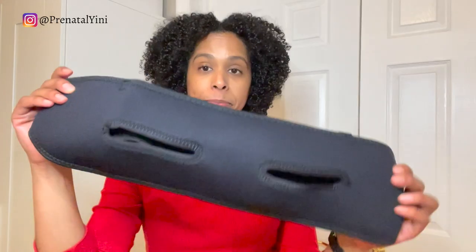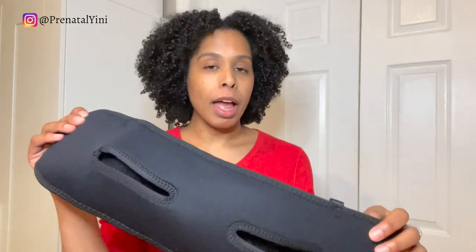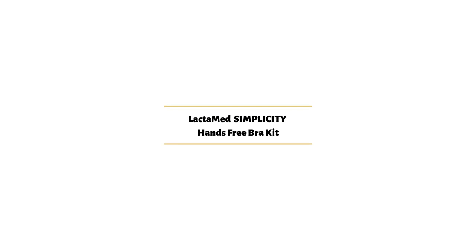Next up is the pump strap — this one claims to be dual as well, so you can breastfeed and pump at the same time. You wrap it around snugly, spin it to the front, and bring it up, adjusting as needed. You're supposed to breastfeed your baby on one side and pump on the other side at the same time.